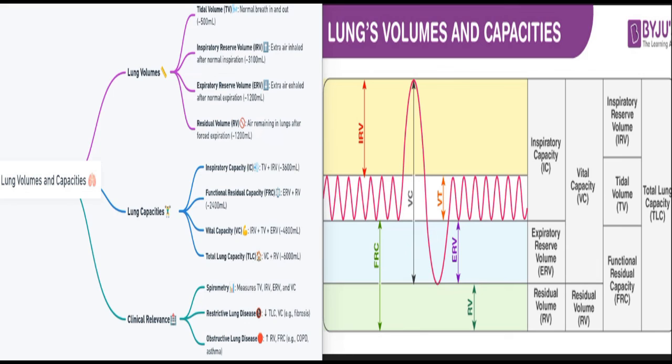With the inspiratory limb, the inspiratory part of the flow volume curve depends on the airway resistance and the strength of the inspiratory muscles, and it's less influenced by airway obstruction than the expiratory flow. Its reduction indicates airway obstruction from extrathoracic reasons.